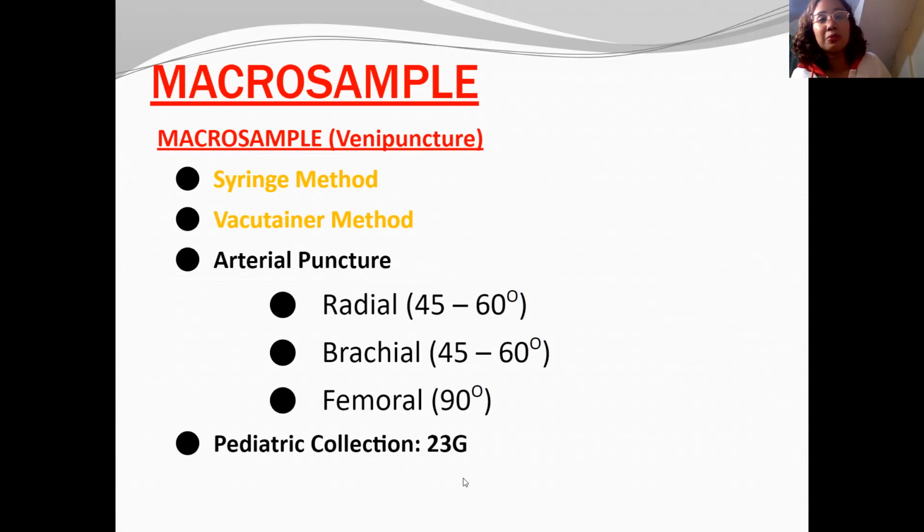Unlike your vacutainer method that sometimes the vacutainers available are only green or blue. Yan, 20, 21 gauge lang available. So sometimes in times where the veins are so small, yan, mas okay na needle syringe method ang gamitin or butterfly method kung meron.